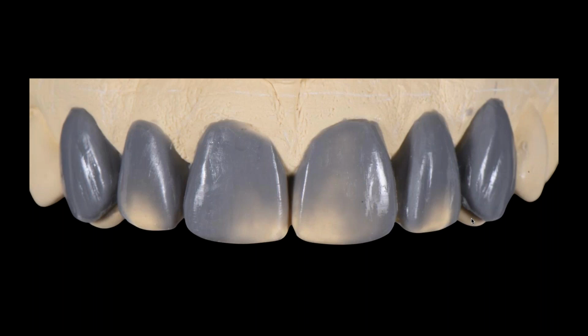My train of thought for aesthetic restorative, I always say, is 2, 4, 8, 10, 12. I don't like doing 6s in general. I feel like it's not a great transition from cuspid to bicuspids. So I think we're always better off keeping the front 2 or 4, leaving the natural cuspids, or if you're going to restore the natural cuspids, then you need to go to at least the first or second bicuspid, depending on the smile dynamics of the patient.